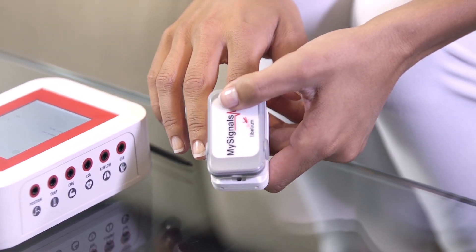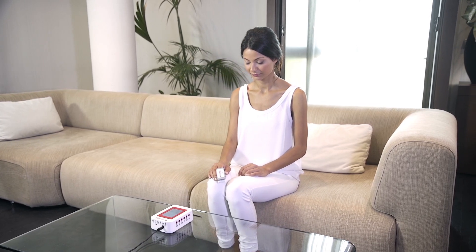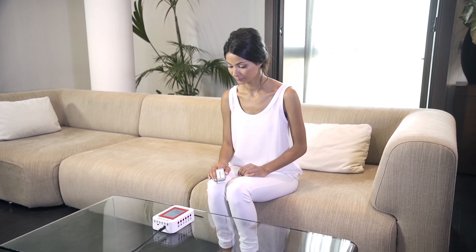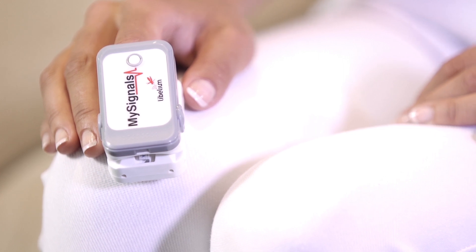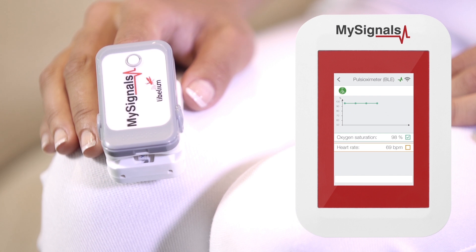Press the Sensor On button and place your finger inside it. After a few seconds, you will get pulse and oxygen in blood values. Now you can visualize your values in real-time on the MySignals screen using the Standalone mode.